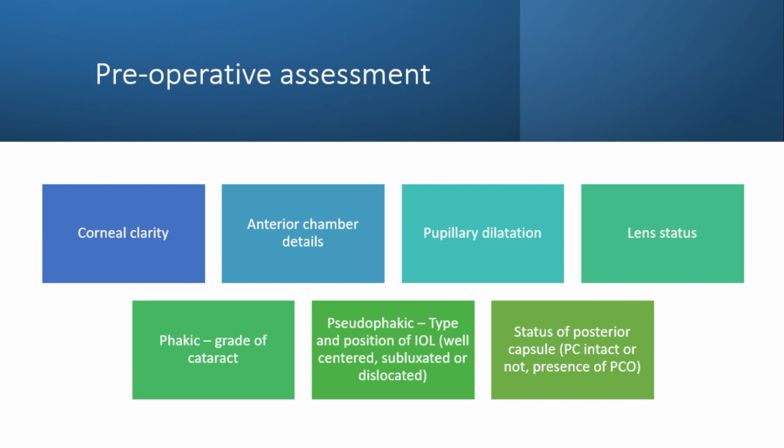That's where it's so important that when you advise surgery, you must put the patient back on the slit lamp and examine the lens carefully to see whether you should plan for a combined cataract surgery or not. It's important to understand that you can always plan for cataract surgery, you need not do it. If on the table you are able to manage, you don't have to touch the cataract, it is fine. But if you don't plan in advance, you miss an opportunity to give them an intraocular lens at the same time.